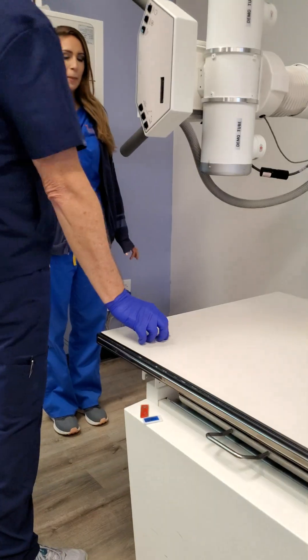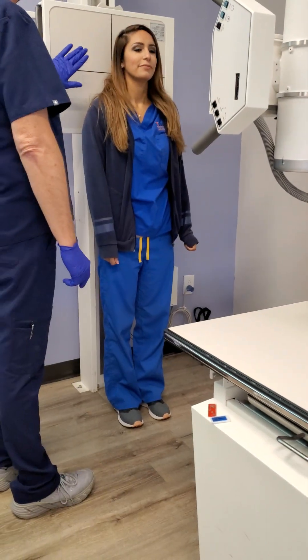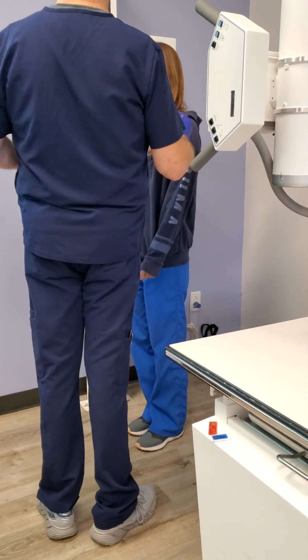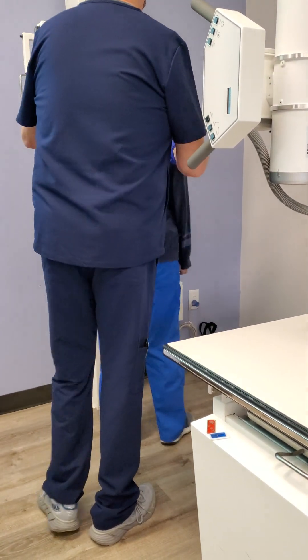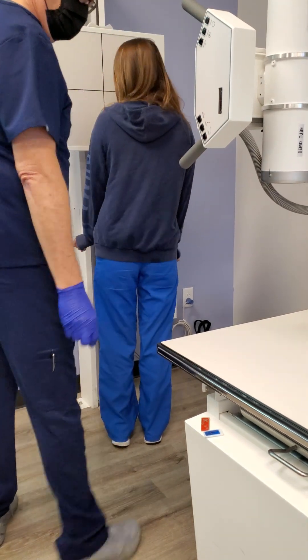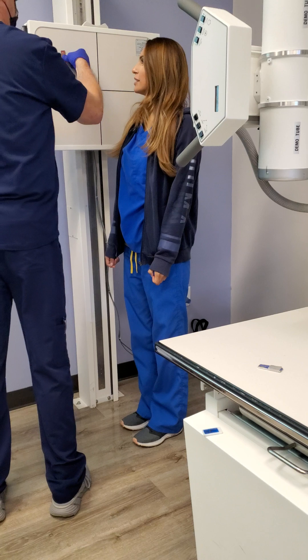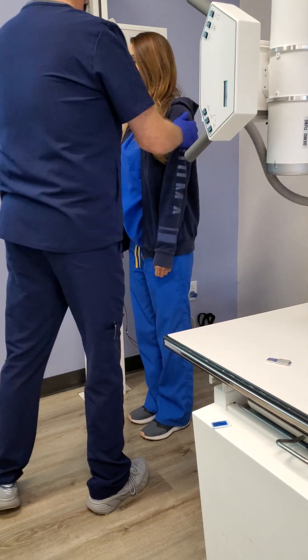All right, so facial bones — we're going to start with the lateral. Let me have you turn with your left side. You know what, let's use the right so we can see better. All right, so face the board.